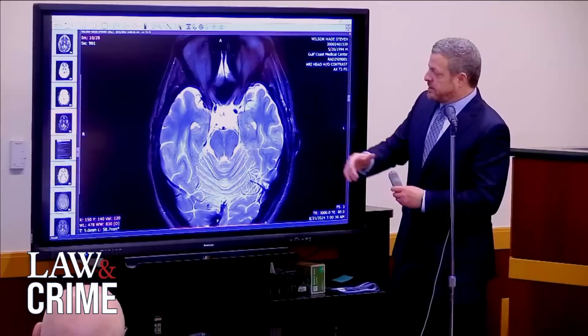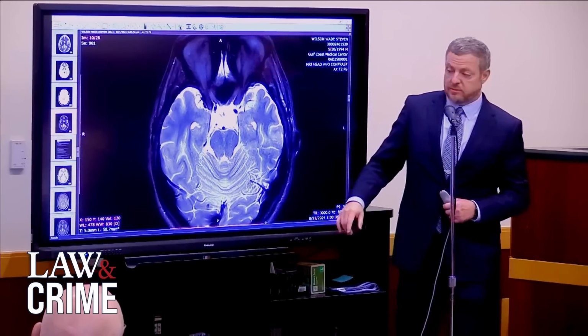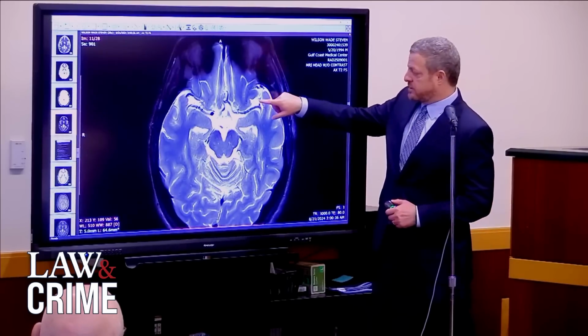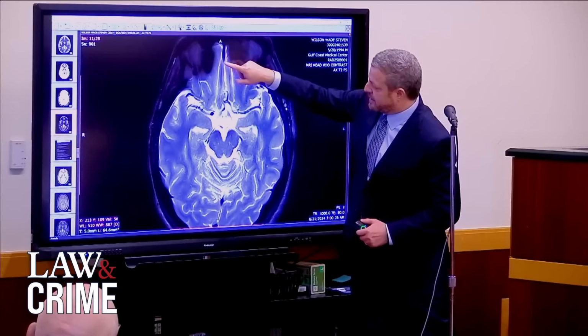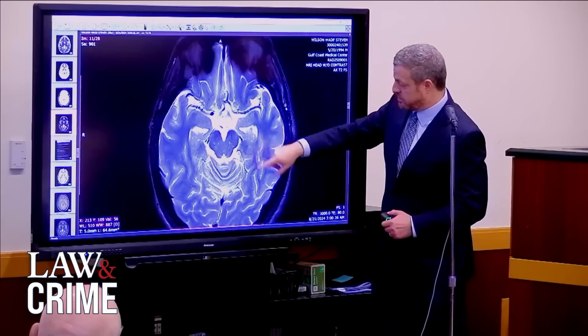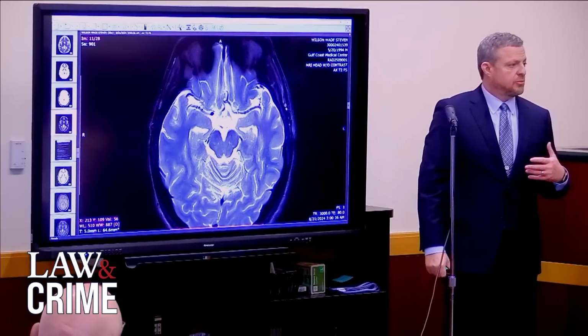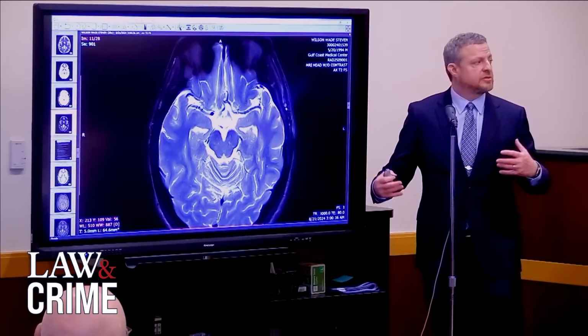Here, and then we start seeing the anterior frontal lobe. You don't even see brain here yet. You just see spinal fluid. Next slide. Next slide. You see the space here, space in between, and the space between here is more than space over here. And that's your orbital frontal cortex, part of your frontal lobe. Some atrophy, not a ton of atrophy, some atrophy.